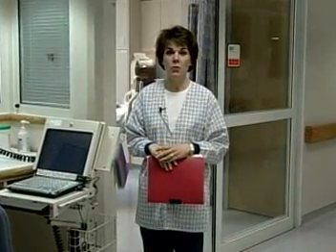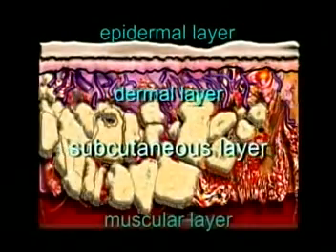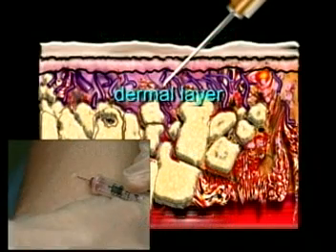Intradermal injections are an important part of nursing practice and a skill that every nurse must learn. This program will identify supplies needed for giving intradermal injections, illustrate landmarks for sites used, and show techniques for giving these injections.